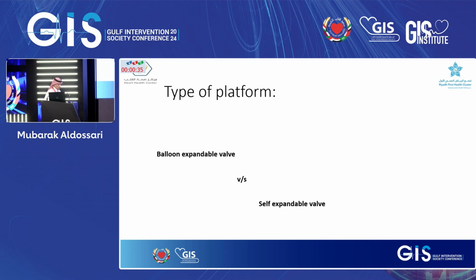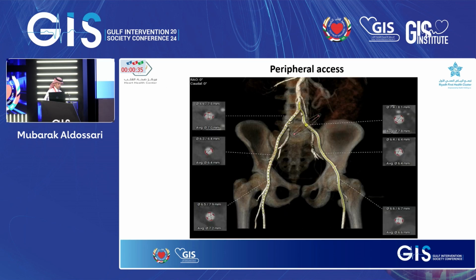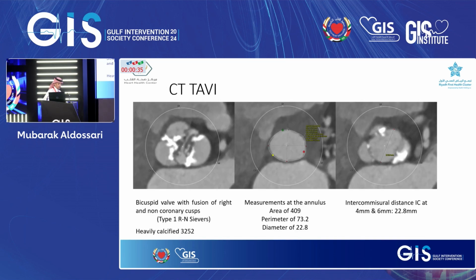Yeah, so I'll just back up a step. There's a couple of high-risk features for TAVR in this case. I would have rediscussed before we went ahead, but assuming we did, because there's a very calcified raphe and a lot of leaflet calcium. If the surgeons still felt it's too concerning, I think we could still go ahead. We did contrast for the CT, obviously, so that was fine.